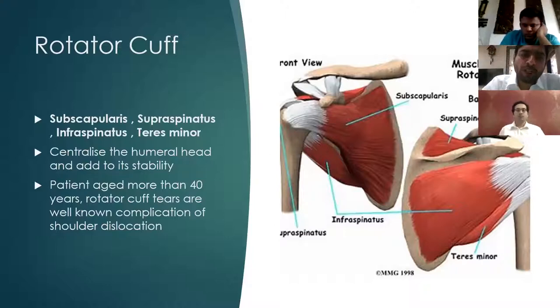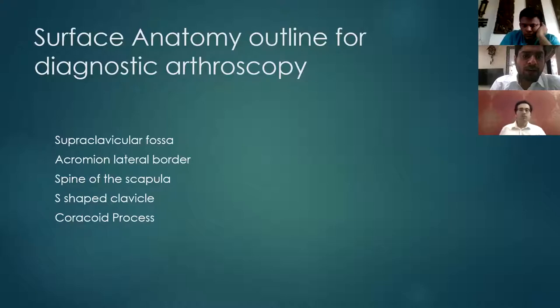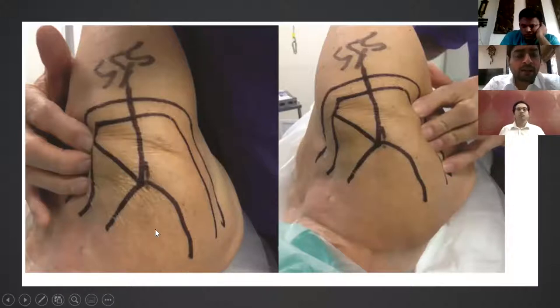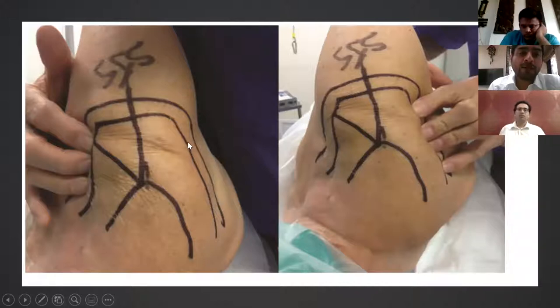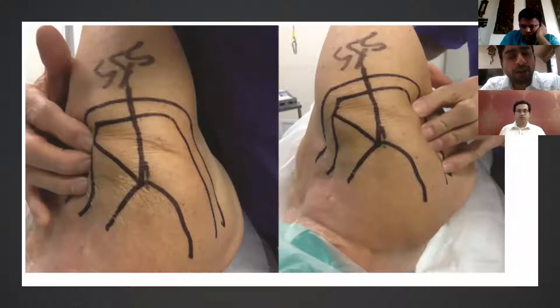For arthroscopy, the patient is placed on the traction table in 70 degrees of abduction and 15 degrees of forward flexion. You palpate the supraclavicular fossa, bounded anteriorly by the clavicle, posteriorly by the scapular spine, and laterally by the acromion. Trace the acromion and coracoid borders as reference lines. Place your thumb in the supraclavicular notch and use the index finger to outline the lateral border of the acromion. Then outline the clavicle, followed by the scapular spine.